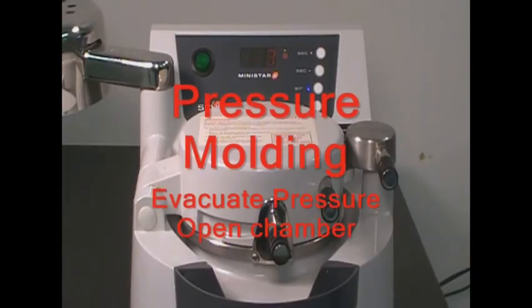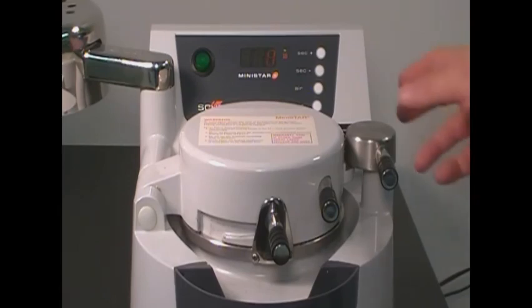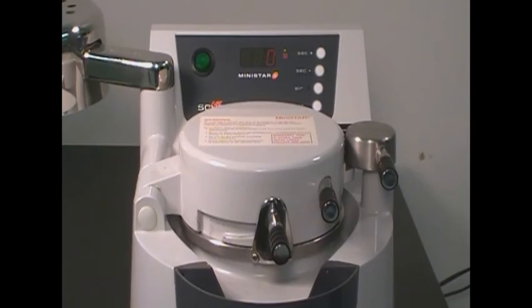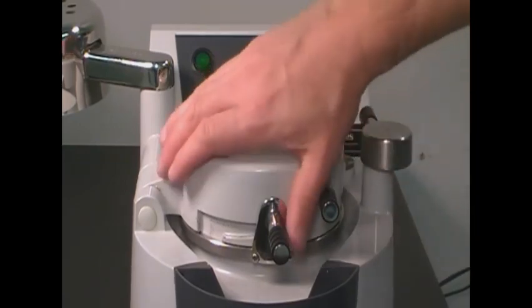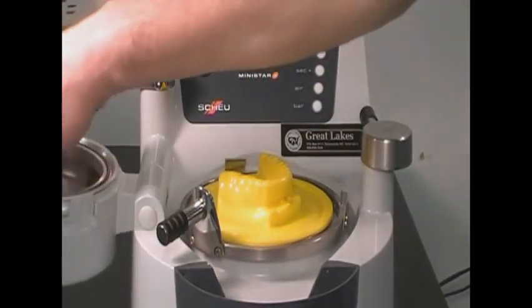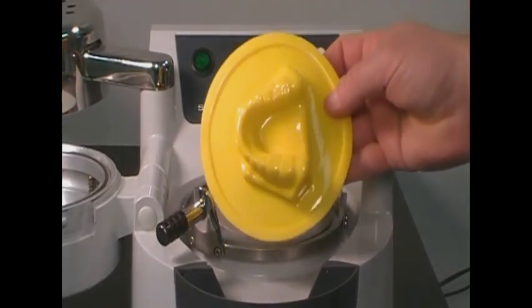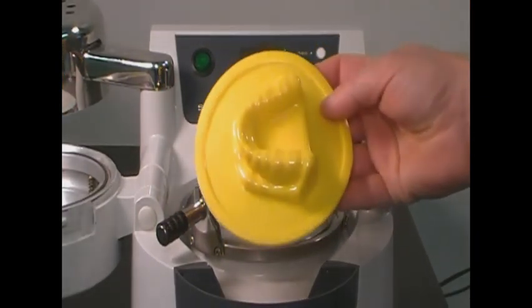A series of beeps will identify the pressure molding and cooling cycle is complete. Evacuate the pressure by pressing the air button. Allow the pressure to completely drain before unlocking the chamber handle. Then unlock the clamping ring or frame holding the material to the chamber and swing open the chamber. Remove the material.